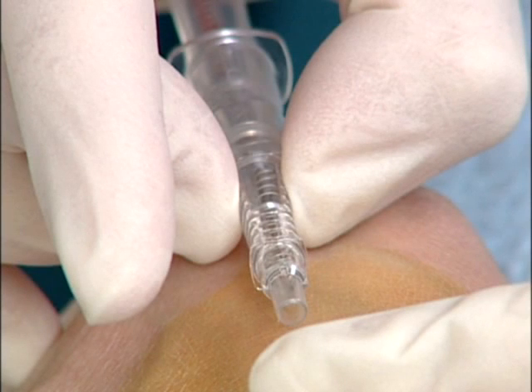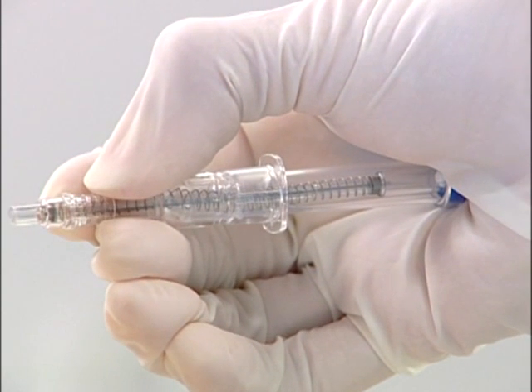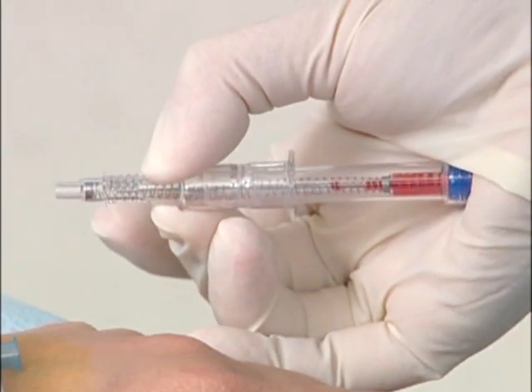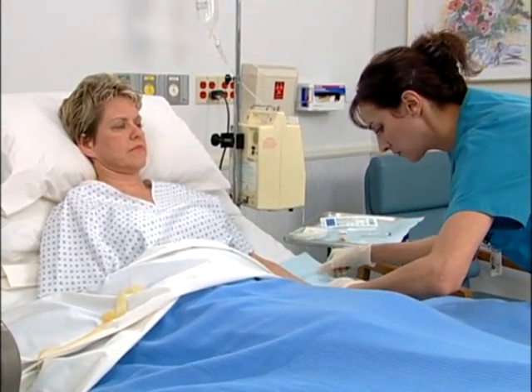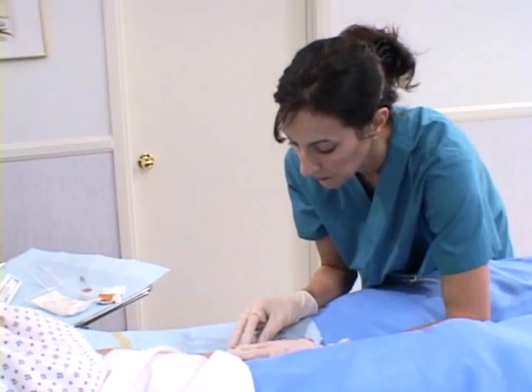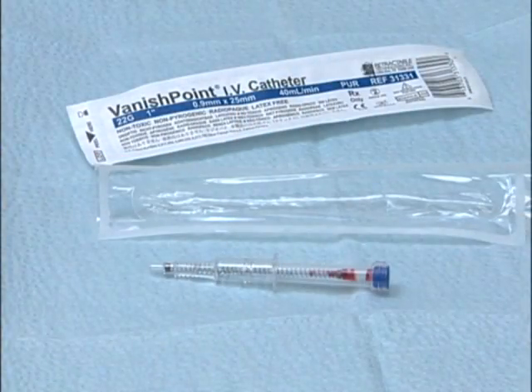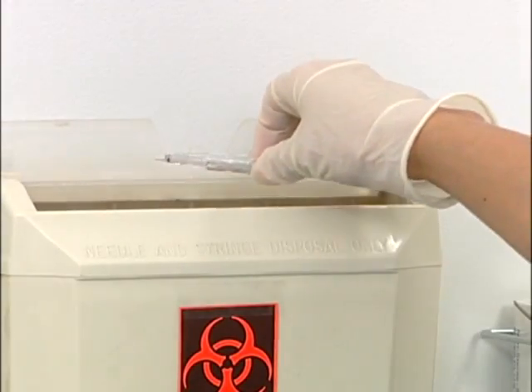Let's see that action again from below. Note that the end of the housing is pressed into the palm. Pull back on the finger grips and the needle retracts into the housing, reducing the risk of a needle stick injury. You can see the spring and needle entirely within the clear housing. Then attach IV tubing or an adapter to the catheter hub as you normally would. Secure the catheter in place and dress the site in accordance with your facility's protocol. Dispose of the introducer needle in an appropriate sharps container, following the policy of your institution.